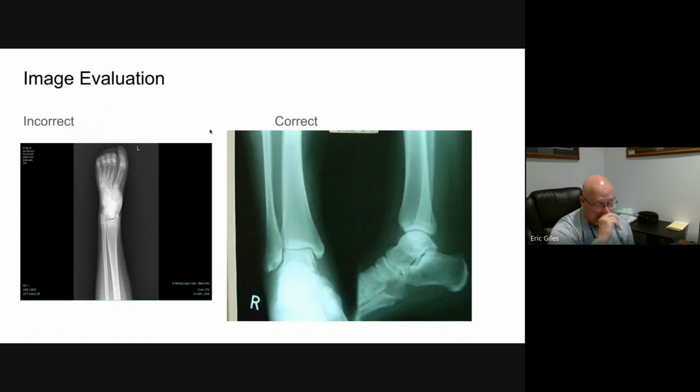Okay, an ankle. Now we learned that ankles are hung from the hip down, okay? So this is a picture actually taken in IF, and it's a nice ankle. Good job. But it's hung upside down, okay? We know that ankles need to be hung from the hip. So we move over, we flip that image around, right? And this is what it's supposed to look like on the right, okay? Hung from the hip, right? All the way down to the ankle.